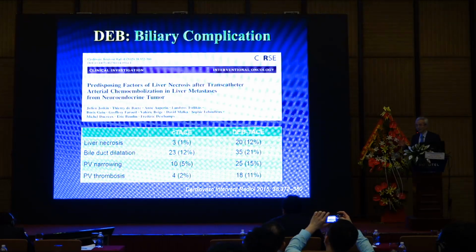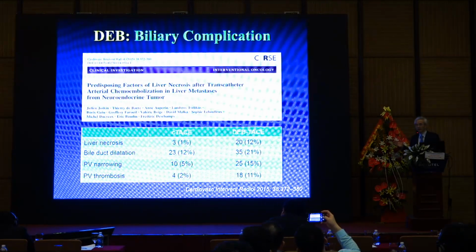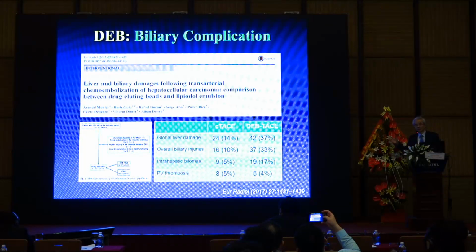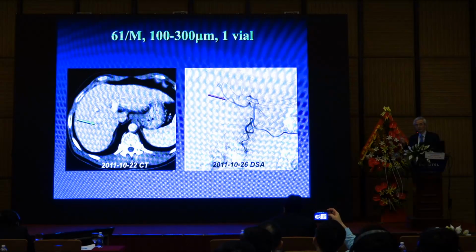We can find 2 reports comparing conventional TACE and DEB-TACE about biliary complications. Both papers reported 2 times higher biliary complication in DEB-TACE. But please remember that these reports are based on rather non-selective procedures. So if you perform DEB-TACE very selectively, there is no risk of biliary complication.